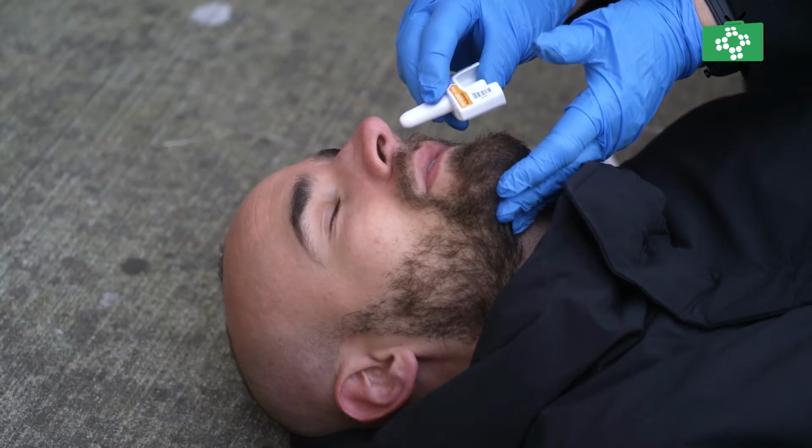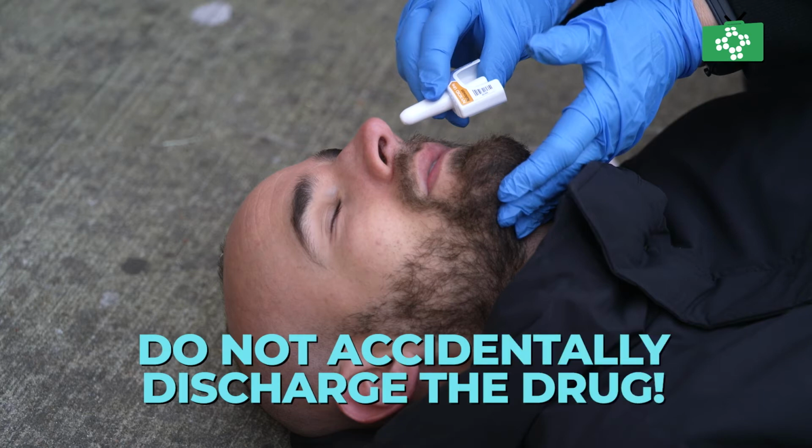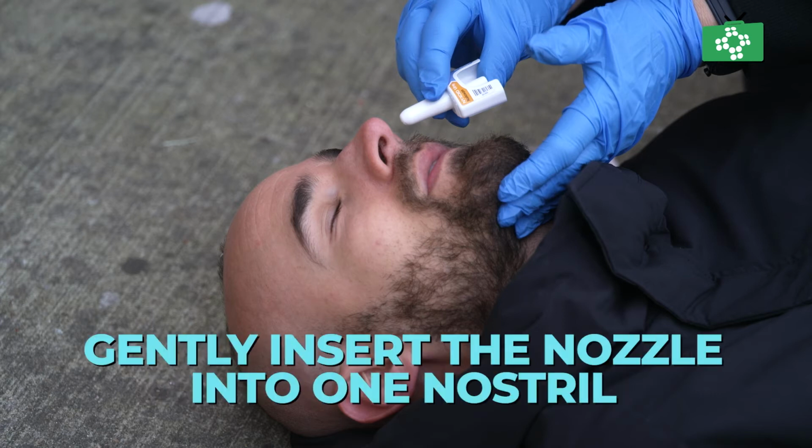One press of the plunger will give you an entire dose, so accidentally pressing the plunger will cause that nasal spray to be rendered useless. Hold the nozzle between your first 2 fingers with your thumb on the plunger. Then gently insert the nozzle into one of the nostrils. Be careful not to go too far up, because this could either block off the end of the spray or damage the inside of their nose.